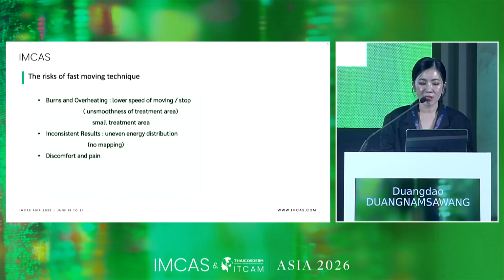Another risk is the inconsistent result, because when you are moving, you can't do mapping, because there's no mapping. Maybe uneven energy distribution, the energy is accumulated in one area. The last one is about the discomfort and pain, because when we move, we press down on the skin, and the patient feels discomfort.